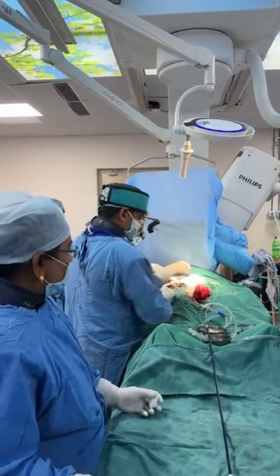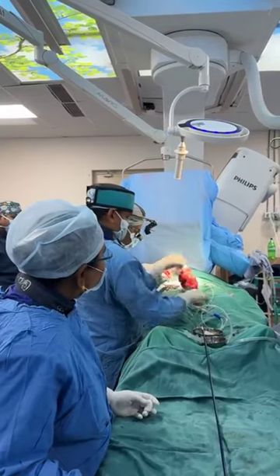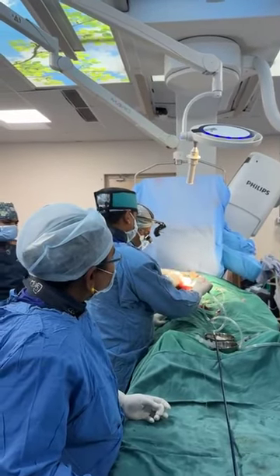You have a clamp? These clots may get pushed with that. Suction working?